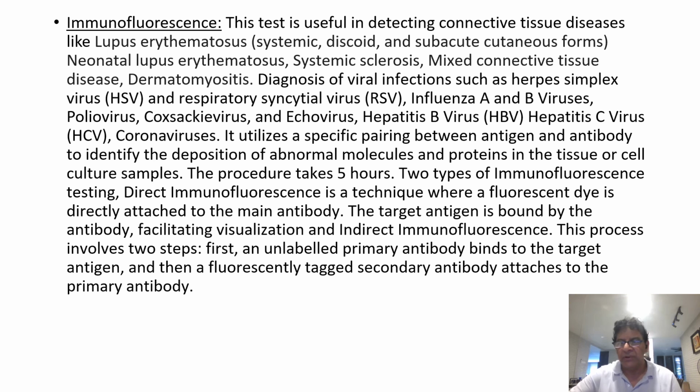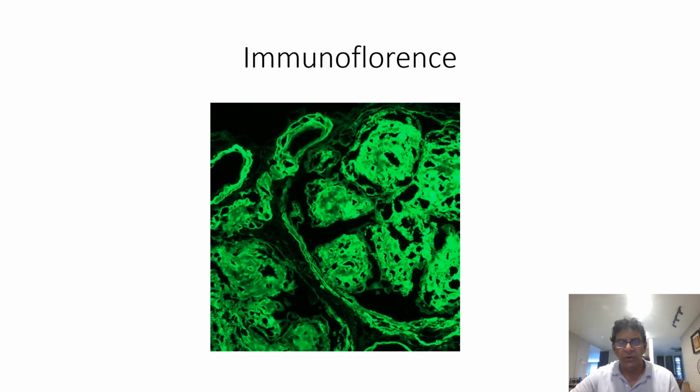And here's a sample of how the immunofluorescence appears. This is a test to show you. The highlighted area is the immunofluorescence test.